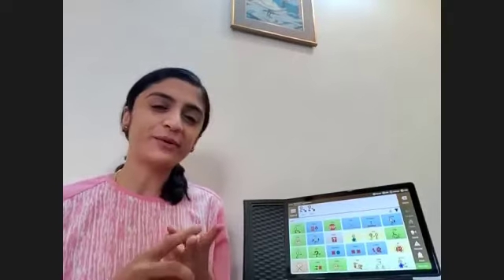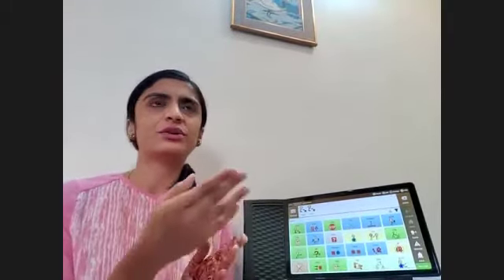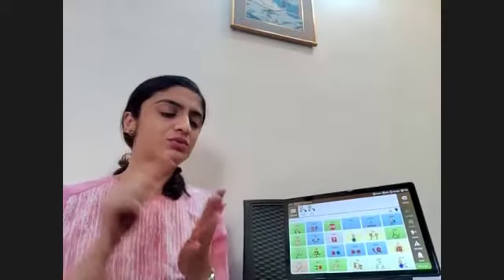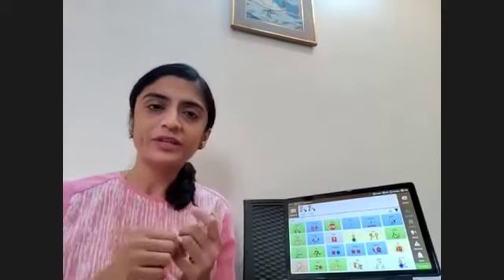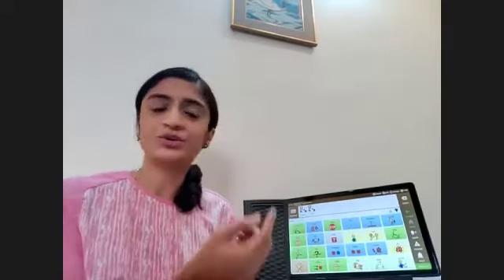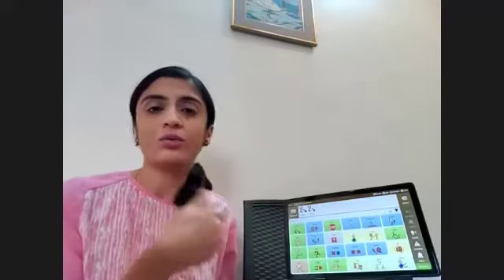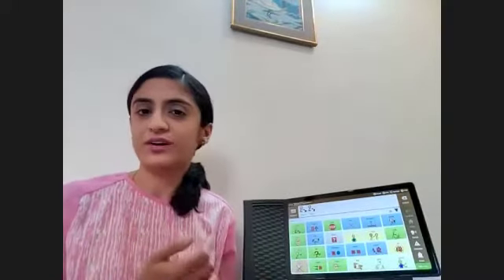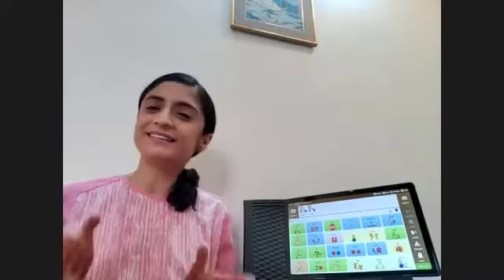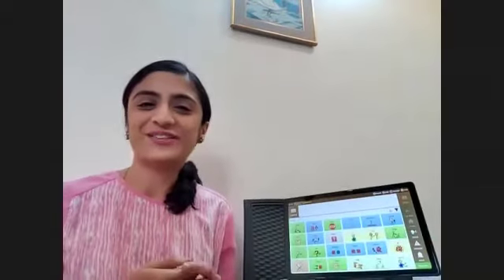And the second thing that I want to mention is you don't need to model the entire sentence. So you don't need to model, I want to read a storybook. You can just model a few words. So like I chose to model want, but you can choose to model I want or I want book. Either of that works. So that's a little bit about modeling. Hopefully that was helpful. And you can use it along with the story today.